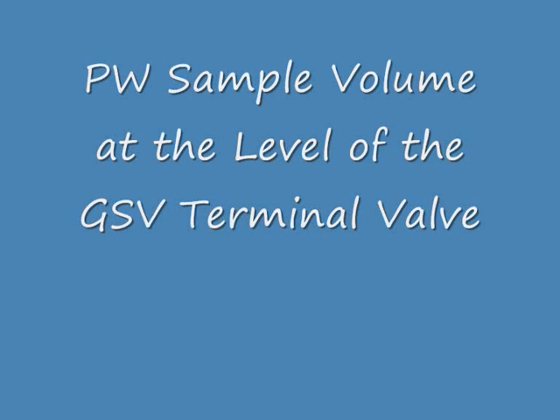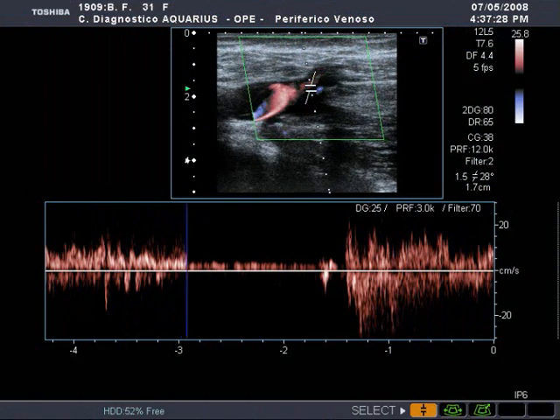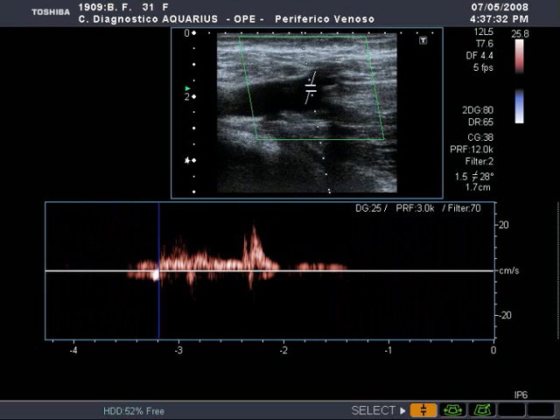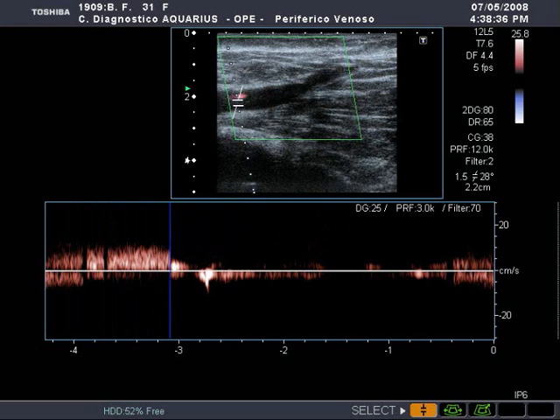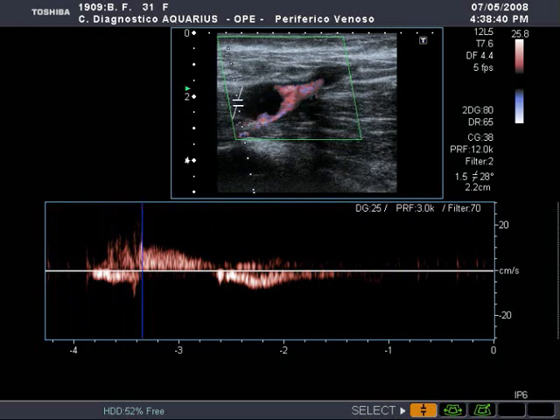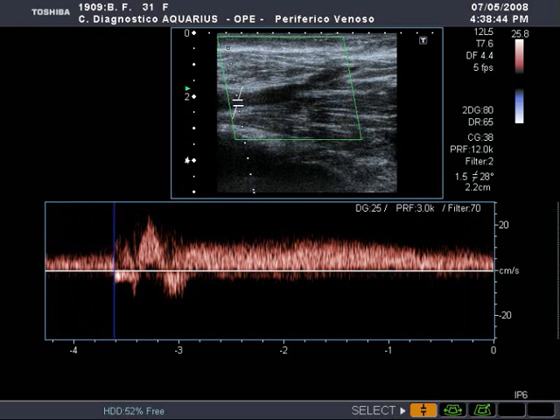Flow in the medial circumflex femoral vein was directed towards the common femoral vein, both in the hypertensive and in the relaxing phases of Valsalva. Hypertension was only the cause of the deviation of flow from the anterograde direction into the iliac vein towards a retrograde flow reflux into the GSV.